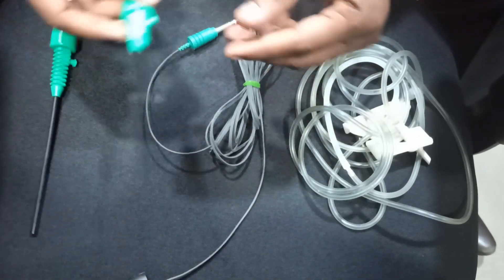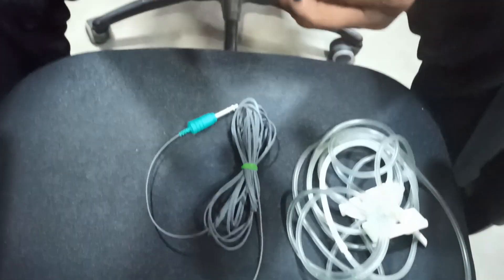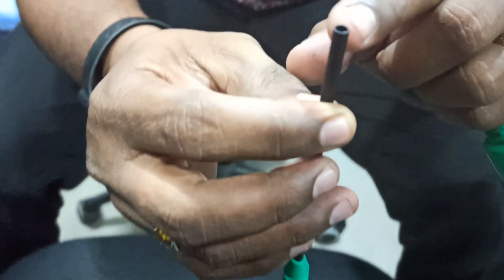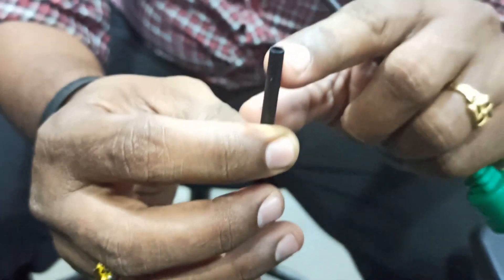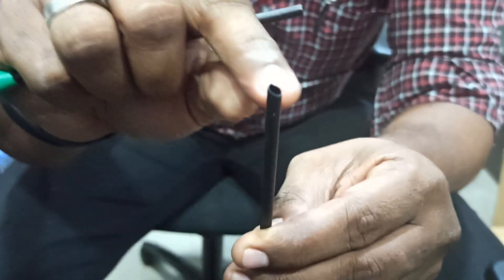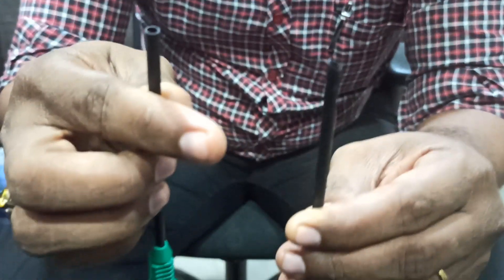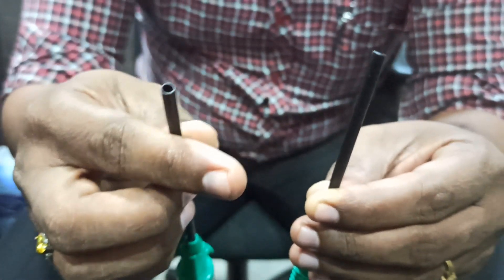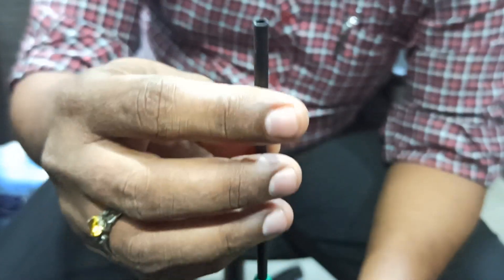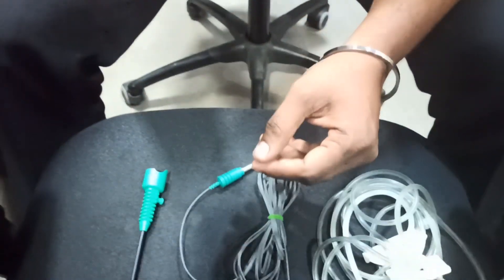First, take the scope sheath according to the scope. For example, this is zero degree — the angulation is flat, so this is zero degree. This other one is around 45 degree; you can see the cutting edge is 45 degree. So if you have a 45 degree scope you use the 45 degree sheath, and if you have a zero degree scope you use the zero degree sheath. Generally people will use the zero degree sheath.